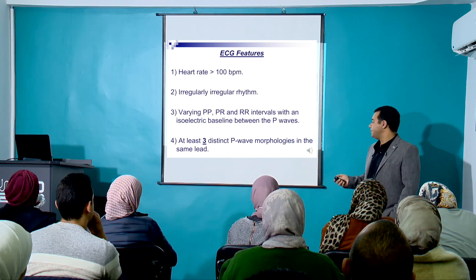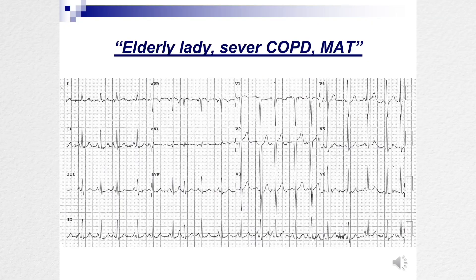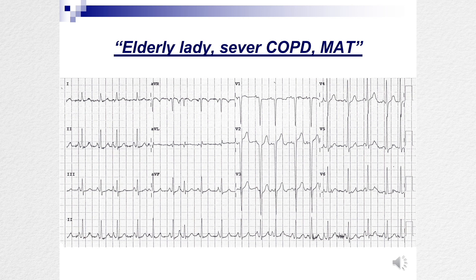Let's have a look at this example. Are we in narrow complex? Yes. Irregularly irregular? Tachycardia? Yes. Now P waves — one shape, different, third, fourth. MAT.